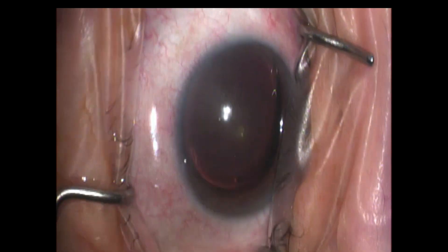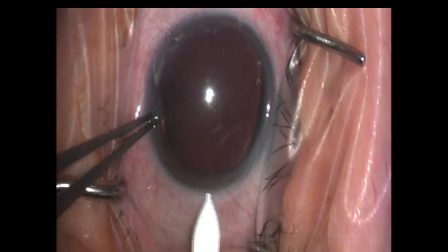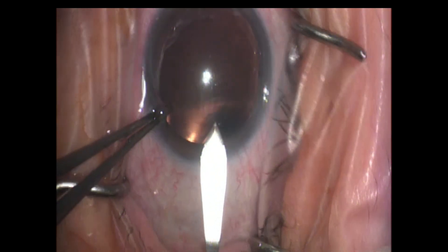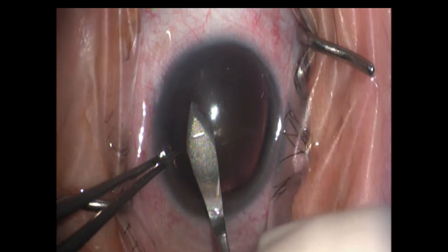We started with our 1 millimeter diamond blade. We're coming in with our 2.2 millimeter main incision wound right here. We're going to create this and then immediately puncture the anterior aspect of the capsule. This is how I start my rhexis.